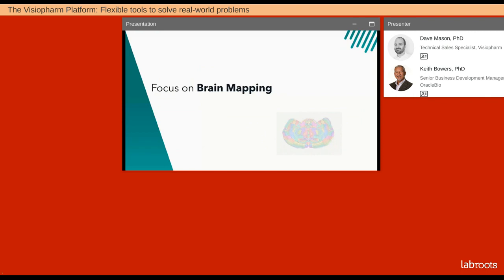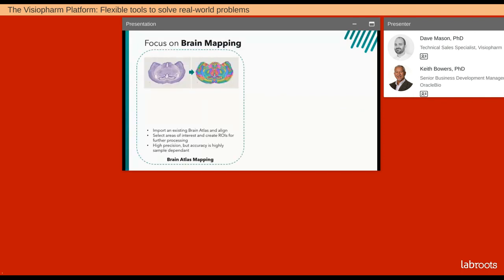The last module I'd like to mention is Brain Mapping. We have two different approaches within the VisioPharm platform. The first uses an atlas — we take our sections, in this case a coronal of a mouse brain, align a pre-built atlas onto the brain, then select regions of interest from the brain atlas at any granularity, up to thousands of different regions within the entire brain stack. These regions can then be converted to VisioPharm ROIs for further processing or analysis. This is a great approach with very high precision, but accuracy is highly sample dependent — if parts of the brain are missing or altered by disease, the atlas may not align correctly. Custom atlases can be created either outside or within the VisioPharm platform.